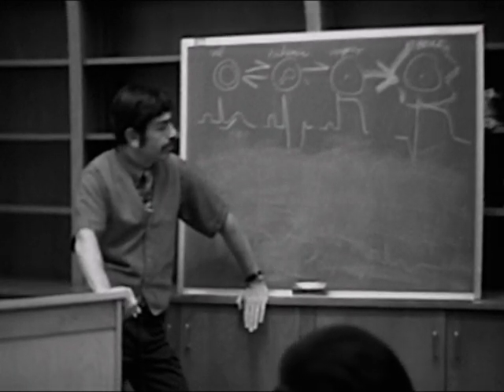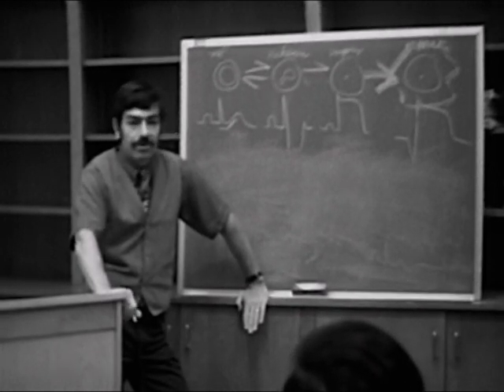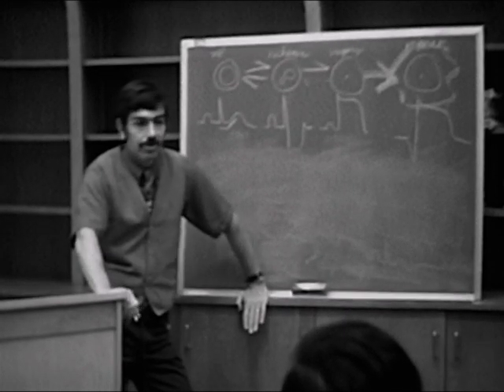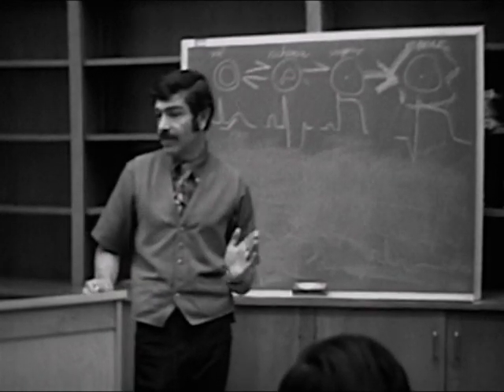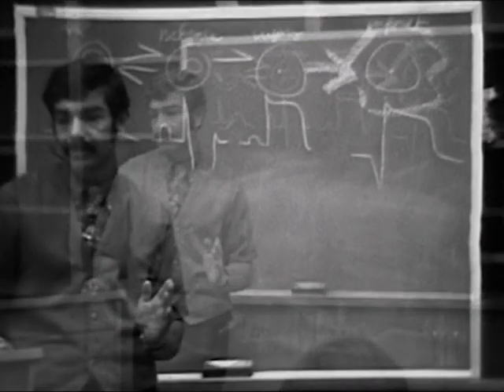Okay, and the first question we're going to ask ourselves is, do we see Q waves in the frontal plane? Are there pathologic Q waves in any of the leads in the frontal plane? Now, it can be normal to have a Q wave in AVR, right? But any other leads, you should not see pathologic Q waves.